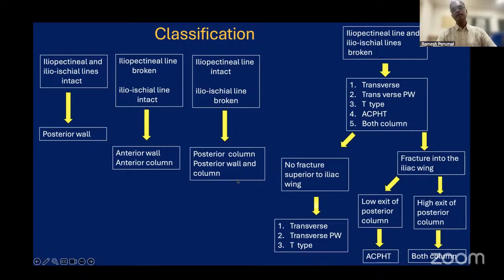So it is easy to diagnose acetabular fractures based on all the lines. There will be a slight overlap of these fracture patterns in an anterior column with posterior hemitransverse and also in both column fractures.